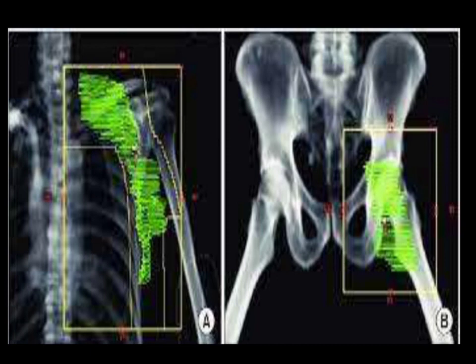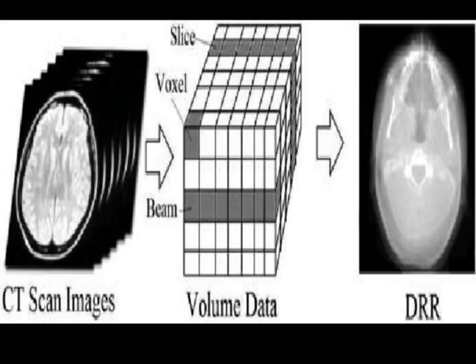understood by your mind. By definition, stereoscopic imaging is a technique used for creating or enhancing an image with depth by taking two slightly offset images separately to each eye of the viewer. Both images are of the same object but taken from a slightly different angle, so it creates a different perspective.